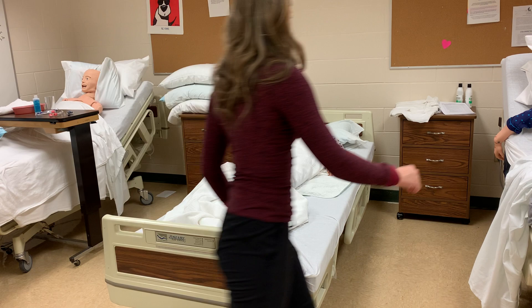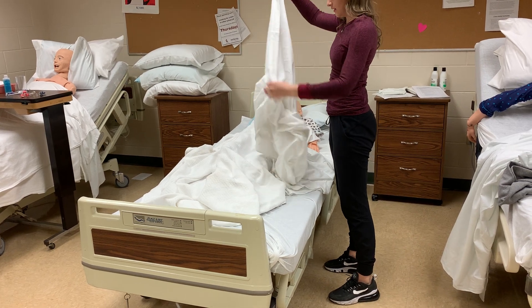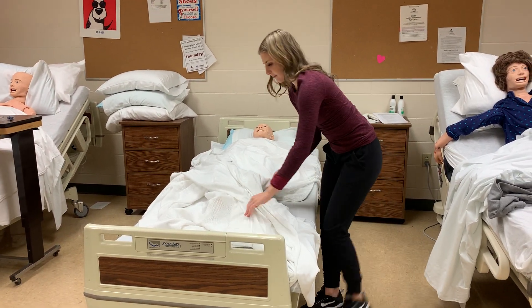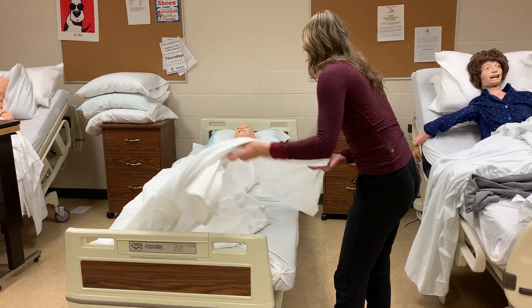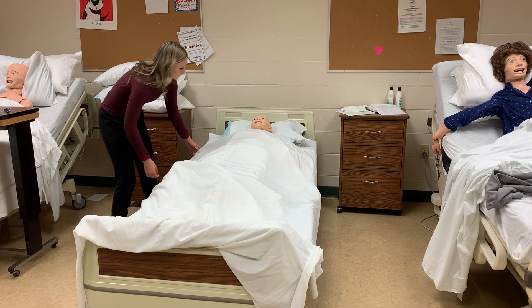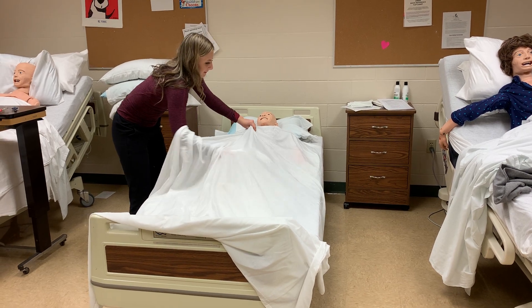From there, you're going to take the clean sheet and line it up on top of the patient. You can instruct them to grab it if they are willing to assist you. Then we're going to remove the bath blanket from underneath this clean sheet that we were using to keep the patient's privacy.